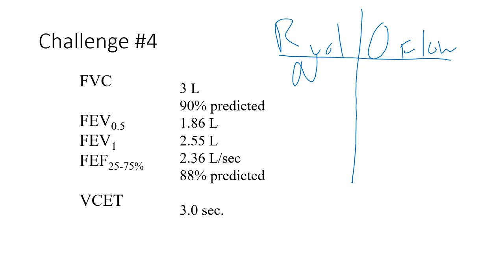So when you're looking at this patient, how do I know what their flow rate was, right? So this is where you've got to compare their FEV1 to, right, I'm hearing you think about it. How do I get an FEV1%, is what we're looking at here. So you're like, I don't know where we're at with this, Derek. Well, I need you to get me an FEV1%, because will I give you this on the exam? Will I make you calculate an FEV1%? Of course I will, right? So if their FEV1 is 2.55 liters, and we're going to divide that by 3 liters equals, anyone? You're just waiting for me to say it. That equals 85%. So normal is anything above 70%. So their flow rate is actually normal as well.